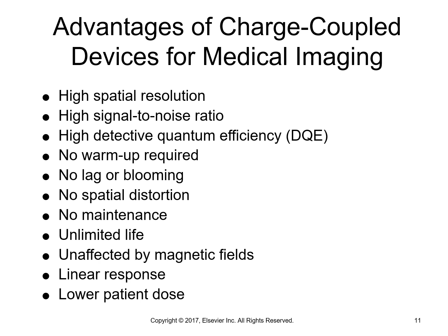So usually the lifespan of the CCD basically outlasts the rest of the fluoroscope. Okay.